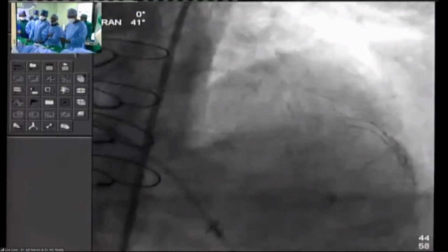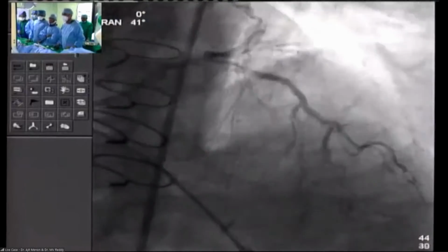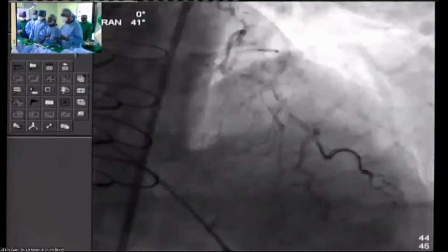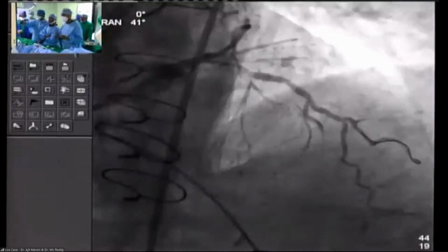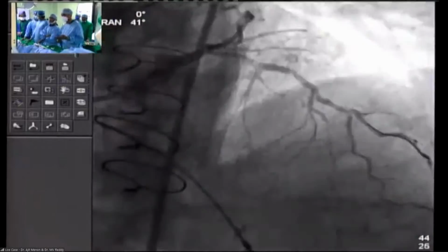Personally, I would stop. Actually, you fixed the vein graft. You had a bad event. It's now restored and stable. So now his ST segments have settled down. His QRS has narrowed down. His ECG is normal. Pressures are normal, and he's not on any supports now.